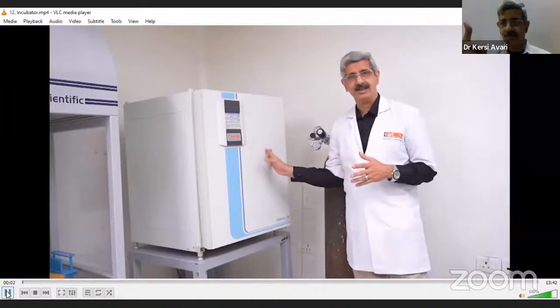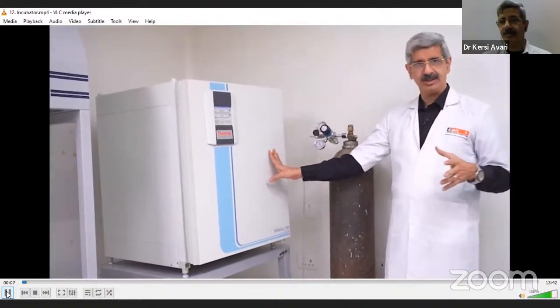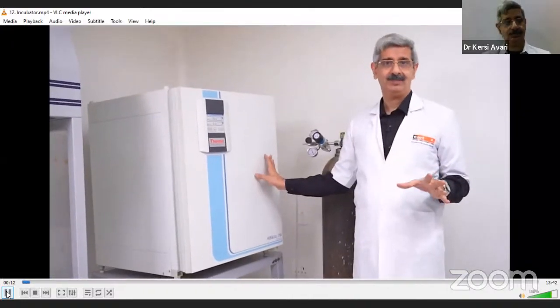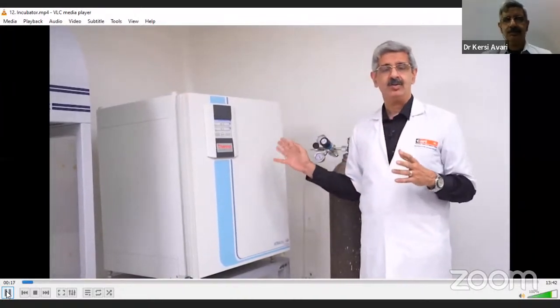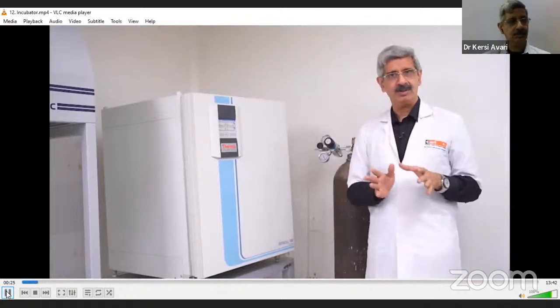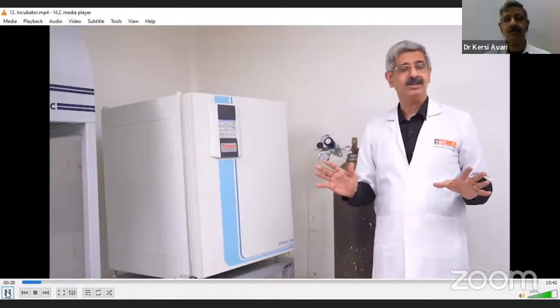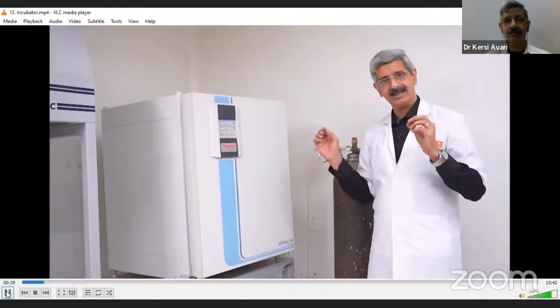To the most important aspect in embryology and the most important gadget, or what I could say the heart of the laboratory, the actual artificial uterus, is your incubator, because this is the main place or the gadget in which your complete process will take place. Right from the time your OCCs are harvested, post pickup incubation, fertilization process, cleavage, uninterrupted incubation, assisted with perfect temperature, perfect CO2 and ambient humidity.